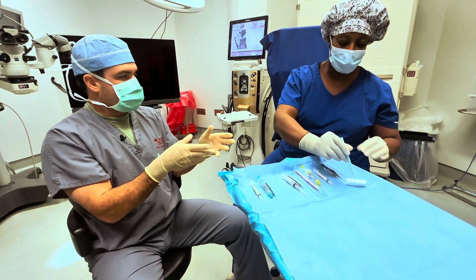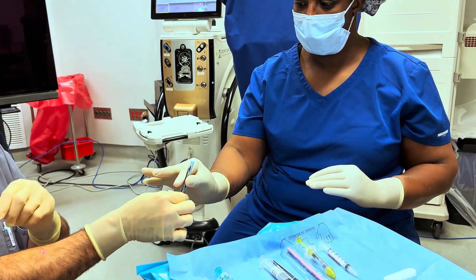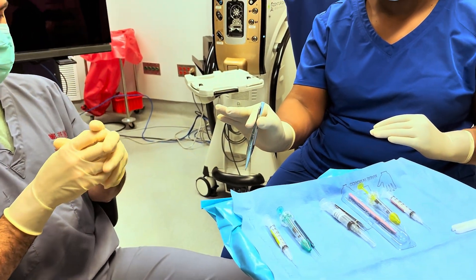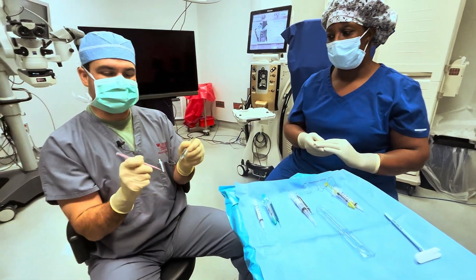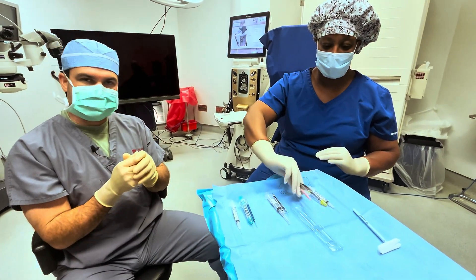Let's do it one more time for clarity. I'm going to allow her to release, hand it back, make sure she's got a good grasp. I don't want it lined up with my leg — I don't want the sharp to fall and stab me. Let's do it with the keratome: she passes to me, she releases, and then I take it. When I'm done, I'm handing it back, I release, and then she takes it away.